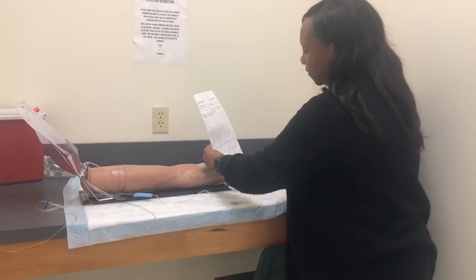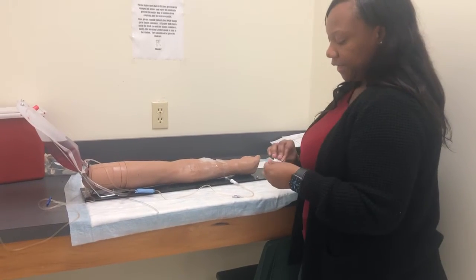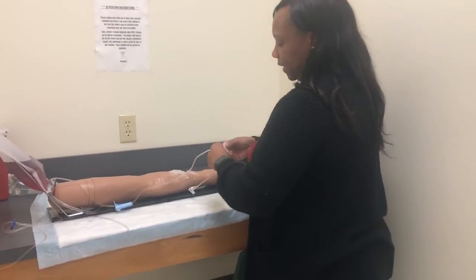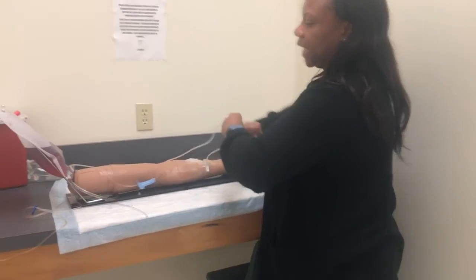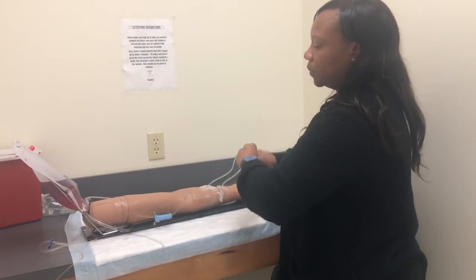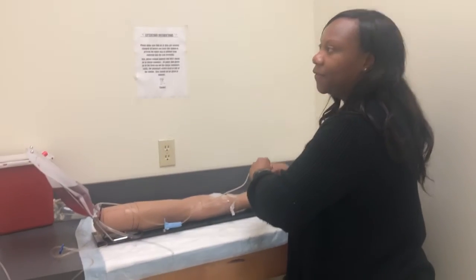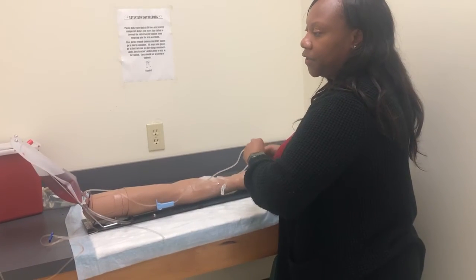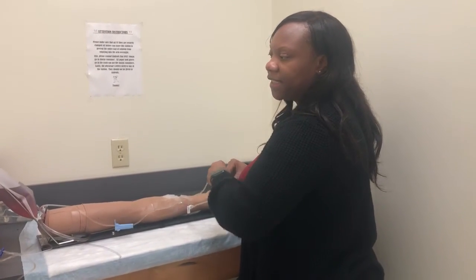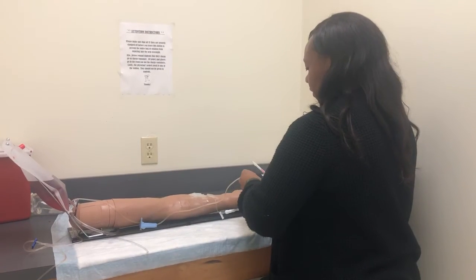And I'm just gonna use this one more time to identify Janet Green. So it's not an IV, it's a saline lock. If it was an IV, I would definitely use gloves. So I'm going to scrub my hub for 15 seconds. And I give it slowly, I'm going to give 1 and 1/2 milliliters over the period of 1 to 2 minutes. I'm going to do it slowly because I don't want to damage her ears, her eardrum, it does cause ear damage.